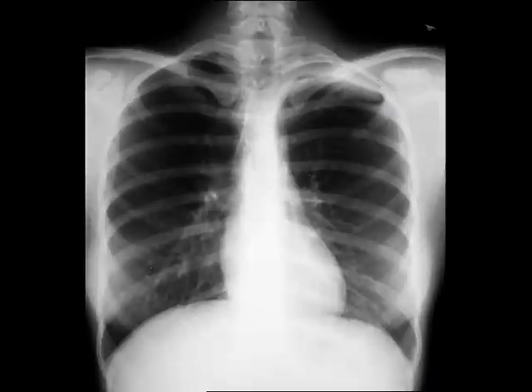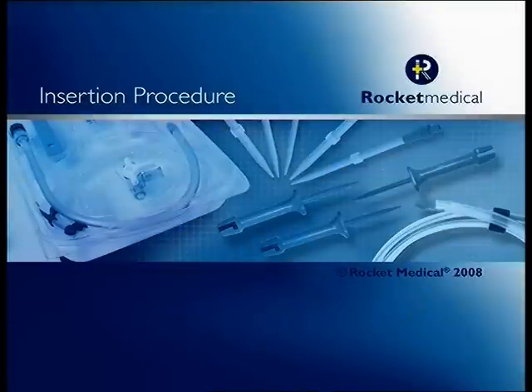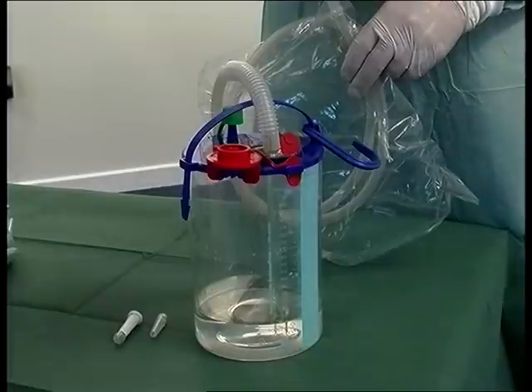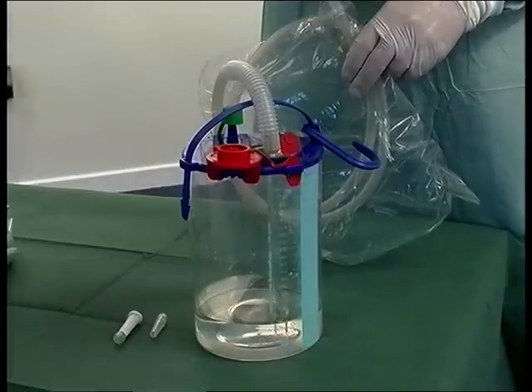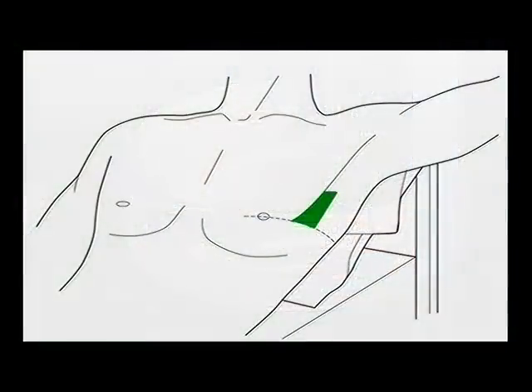First, confirm the diagnosis with an X-ray or ultrasound scan. Prior to commencing the procedure, always ensure the chest drainage bottle has been correctly primed and is ready for use. Identify the correct insertion point. Particular attention should be paid to the safe triangle, as recommended by the British Thoracic Society.